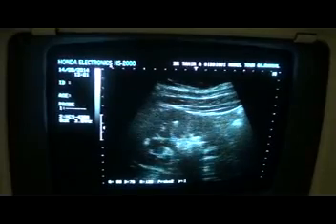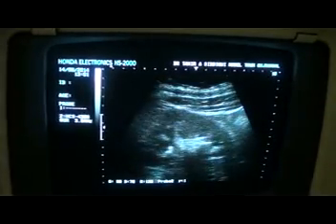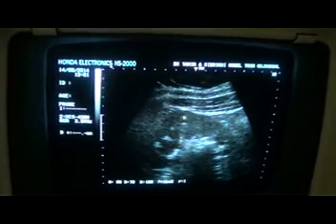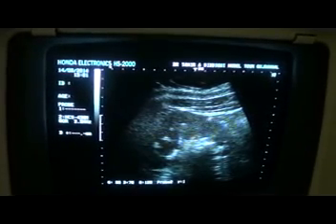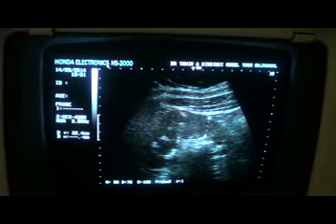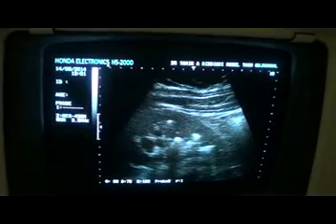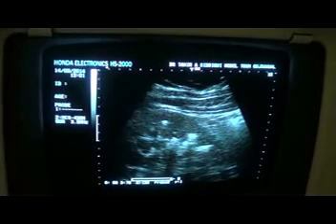corticomedullary differentiation is muffled. The urea and creatinine both are mildly raised in this patient. The reason is that we do not see medulla in this region. There is muffling of the medulla, and all of this up to here is the parenchyma. The upper part is the cortex. No medullary pyramids are seen, and there is muffling of the corticomedullary differentiation. And there are multiple calculi seen in all the calyces from upper to lower pole.